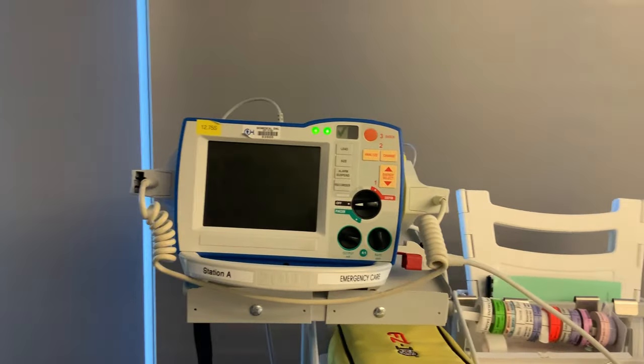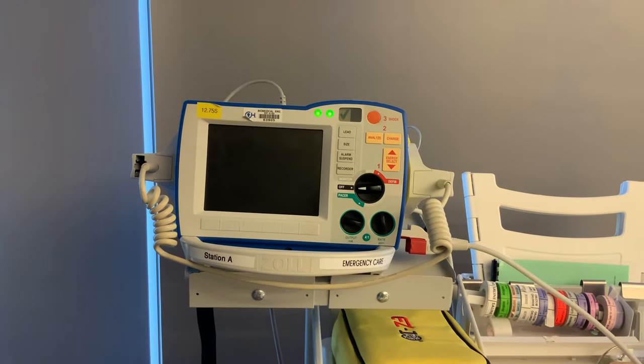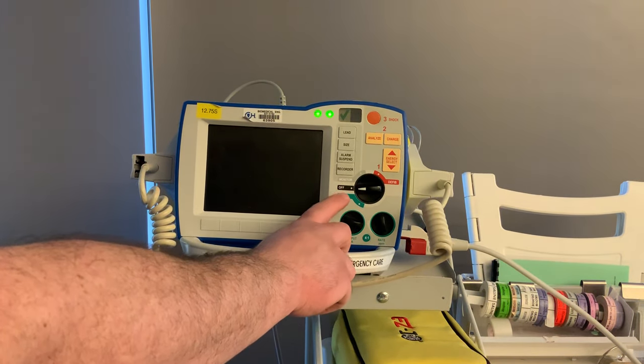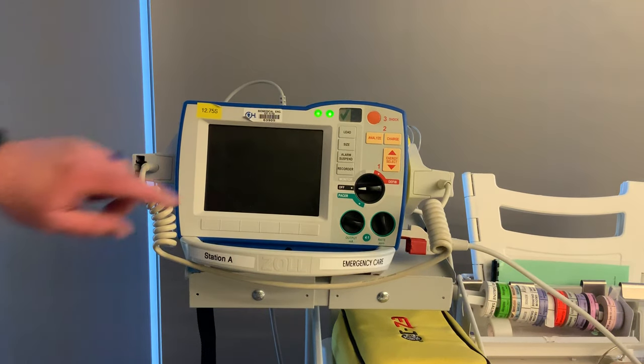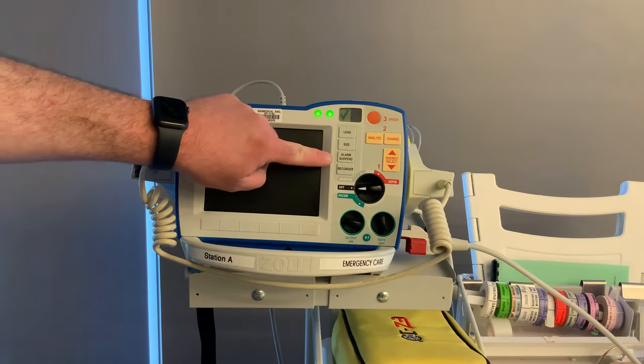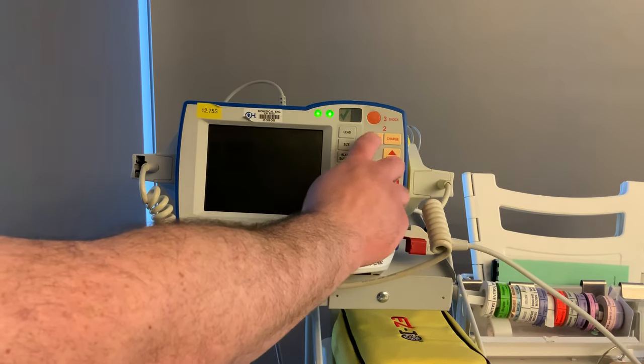Looking at the front of the defibrillator, we have some soft keys on the bottom which are going to come into play later. You have your pacing knobs and your main power knob to turn it from off, monitor, defib, or pacer. You also have soft keys for recorder, alarms, size, and leads, and then your energy select, charge, analyze, and shock buttons.